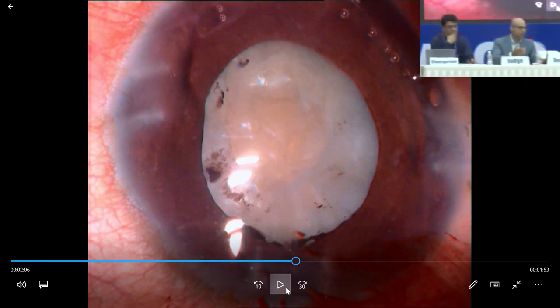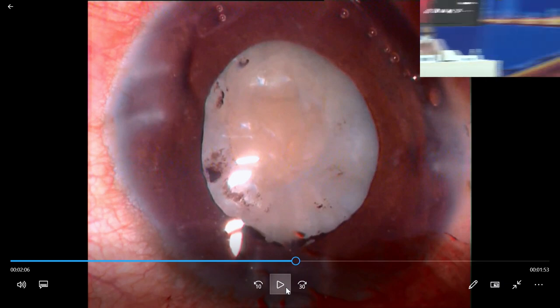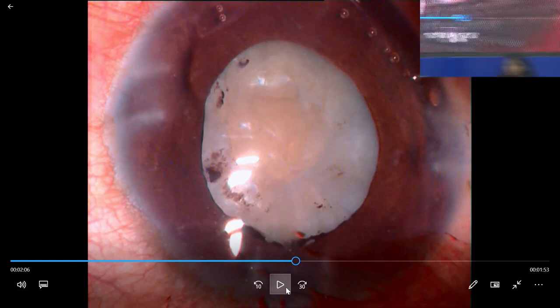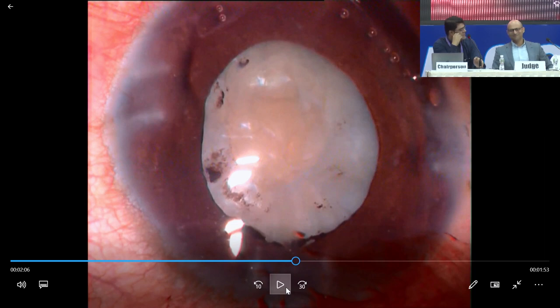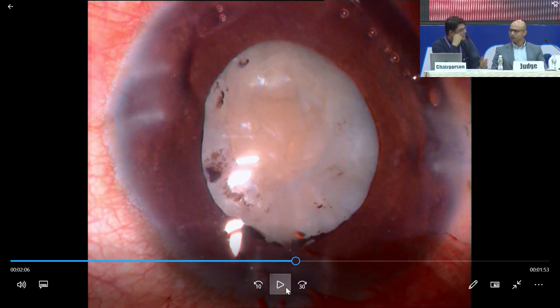Yeah. Also, if you were struggling and it wasn't happening, the next thing to do would have been to use a vitrector. That would have made your life a lot easier. I actually thought of it, but I wasn't very sure whether it would help me or cause more problems. But that thought had gone through my mind when I used the radio frequency capsulotomy probe, which is there in my machine. It just melts the capsule. Yeah, the subcapsular plaques.